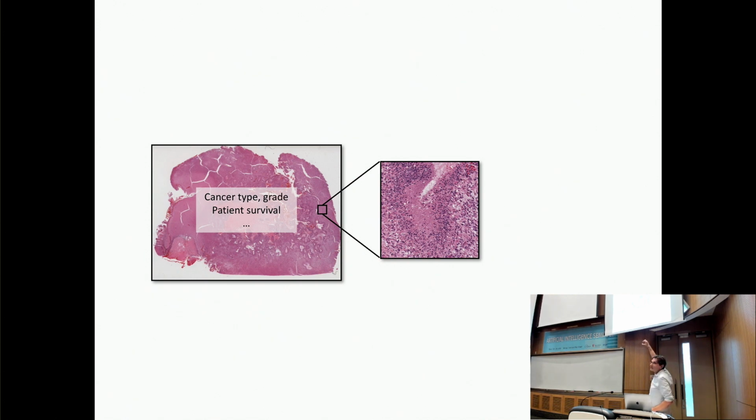Okay, so we decide this on all of the biopsies. Then we can go and look at one particular sample of the biopsy, a little patch. Okay? As I've been speaking, I will be calling this either a window or a patch. I take a little window, and now I can ask what particular classes of structures of tissue are here. Now things are getting technical.